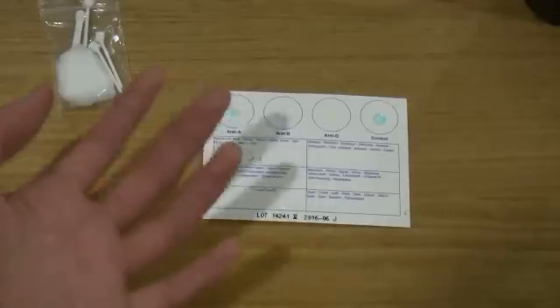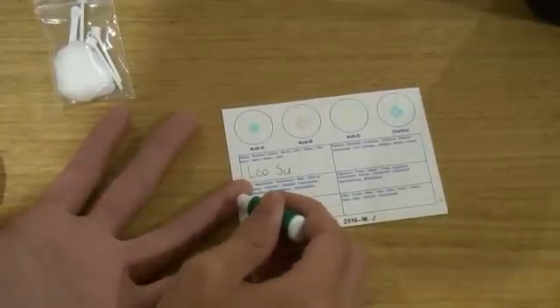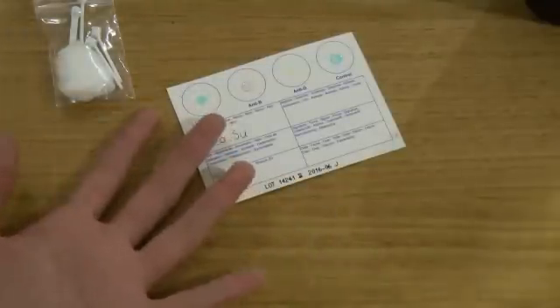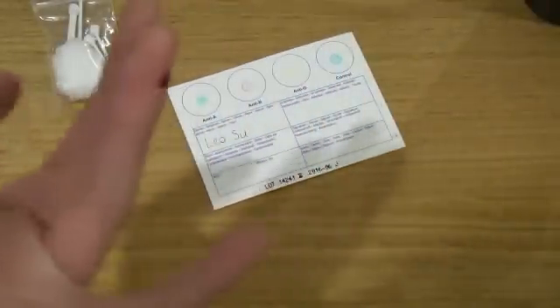And now it's the scary bit where I have to prick my finger. It says to put your hand down, and then you just place it near there and press down. That actually didn't hurt that much — it felt like a stinging pain. And as you can see, blood is coming out.